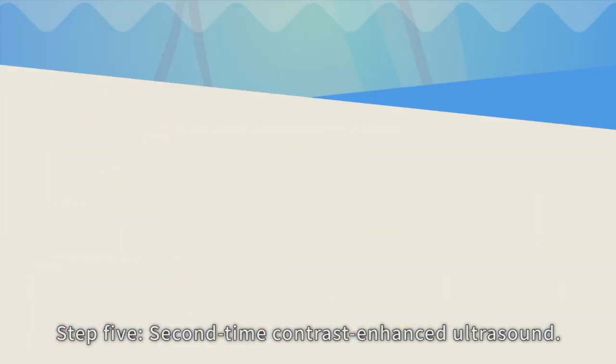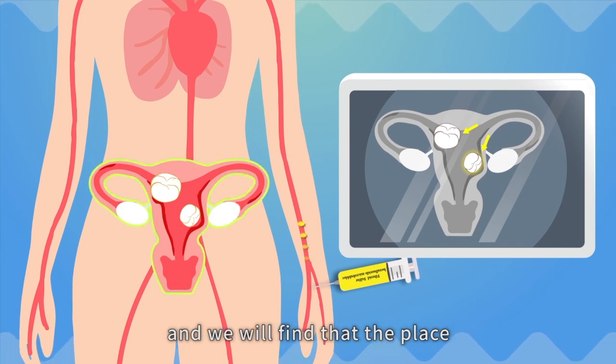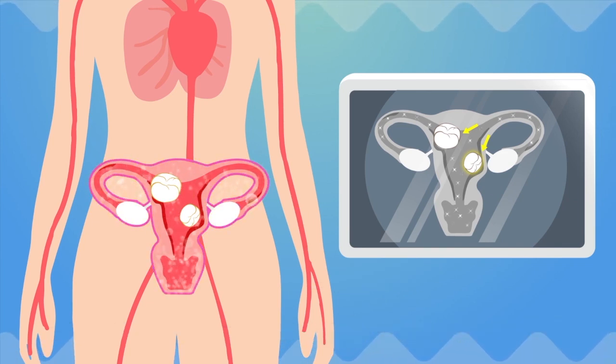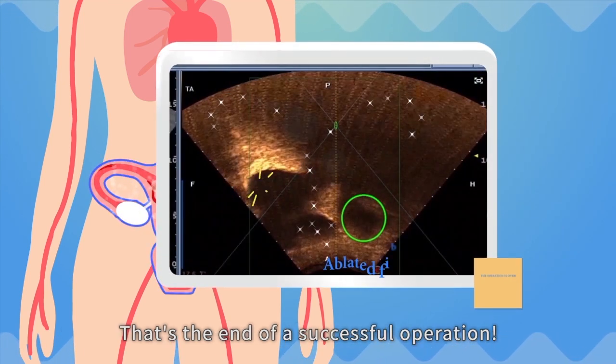Step five: second time contrast enhanced ultrasound. Apply the contrast agents once again and we will find that the place where the fibroid once existed is no longer highlighted, which means the fibroid has been totally eradicated. That's the end of a successful operation.